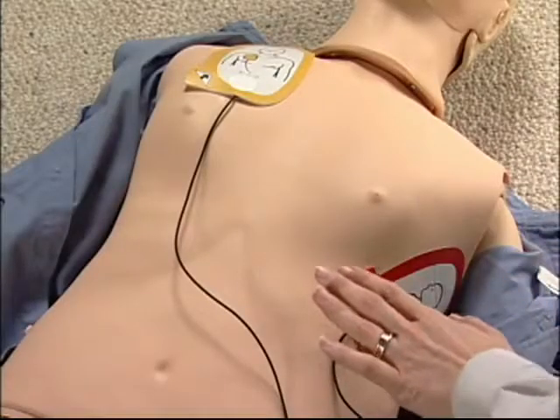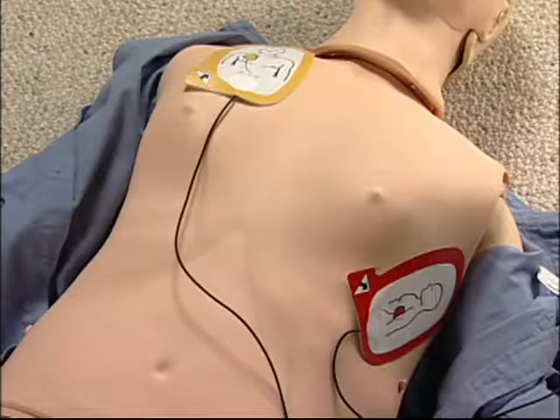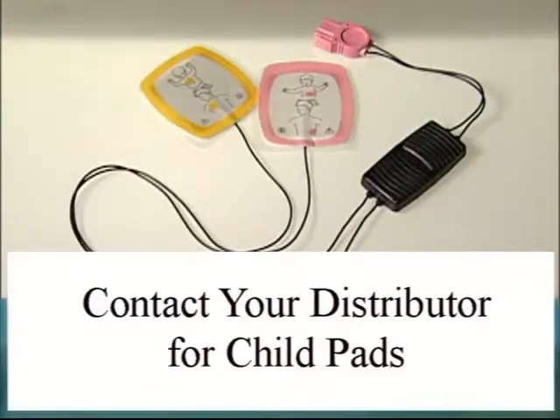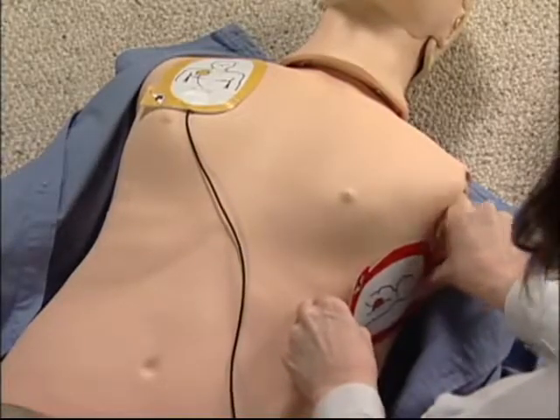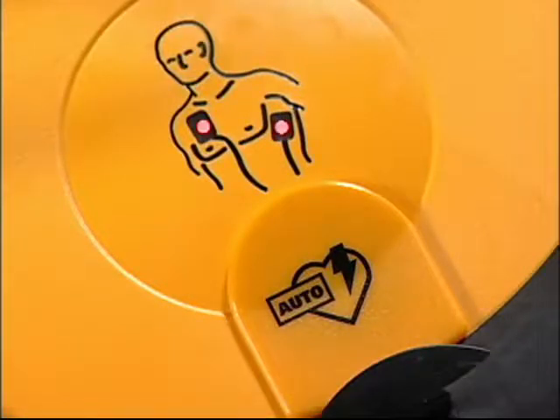These electrodes, the ones that come with the Lifepak AED, are for use on people over 8 years old. There are special electrode pads that are for use with children under 8 years old. If you might need those pads, you should contact Medtronic for more information. As soon as the pads are in place, these lights turn from red to green, and the Lifepak AED immediately starts to evaluate the heart rhythm.